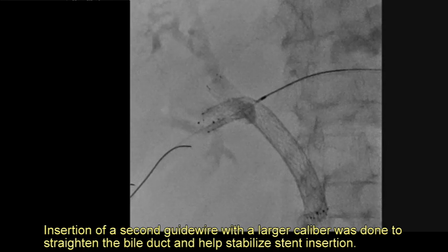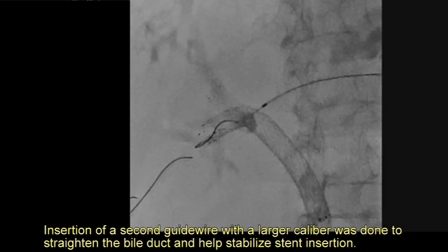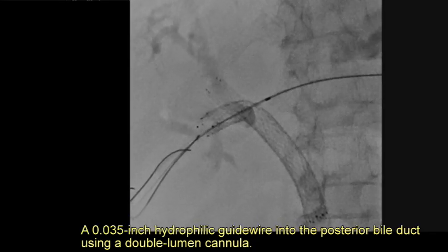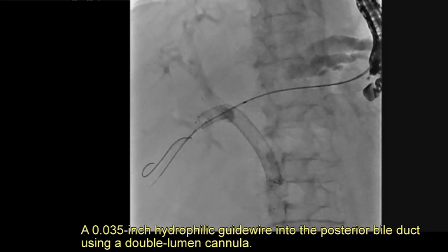A second guide wire with a larger caliber was inserted to straighten the bile duct and help stabilize stent insertion. A 0.035-inch hydrophilic guide wire was placed into the posterior bile duct using a double lumen cannula.